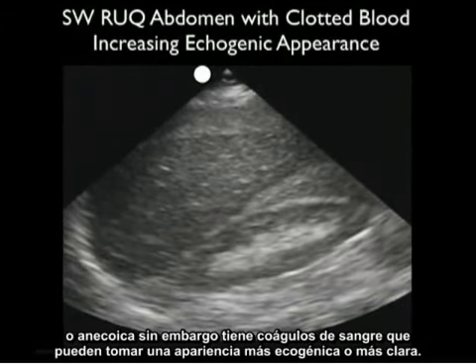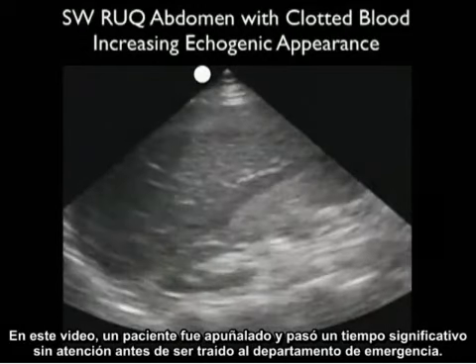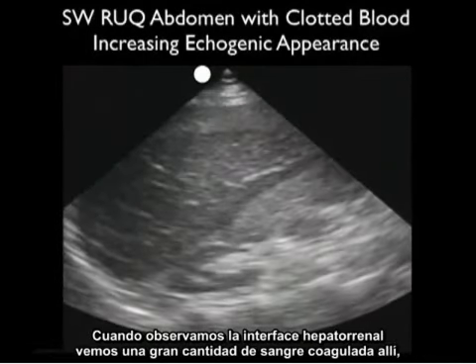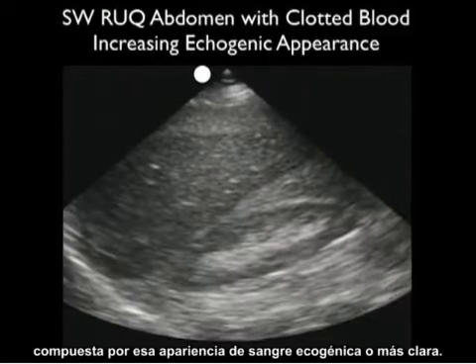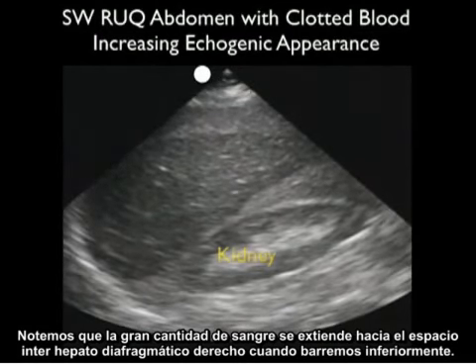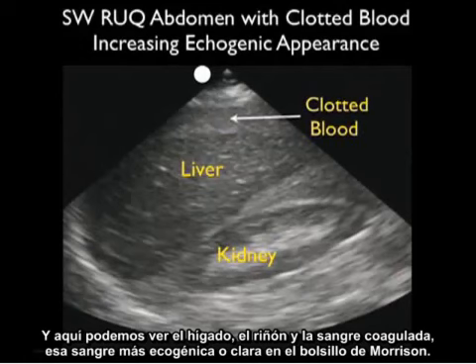However, as blood clots, it can take on a more echogenic or lighter appearance. In this video clip, a patient was stabbed and had a significant downtime before being brought to the emergency department. As we look at the hepatorenal interface, we see a large amount of clotted blood there, made up by that echogenic or lighter appearance of the blood. Notice that the large amount of blood extends into the right paracolic gutter as we scan inferiorly. And here we can see the liver, the kidney, and the clotted blood, that more echogenic or lighter blood, in Morrison's pouch.